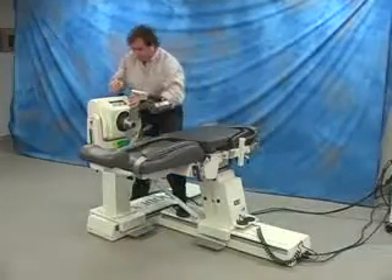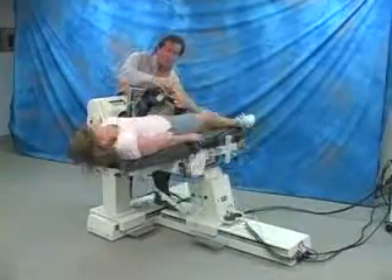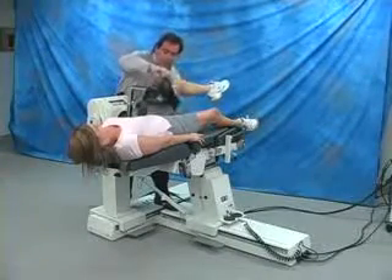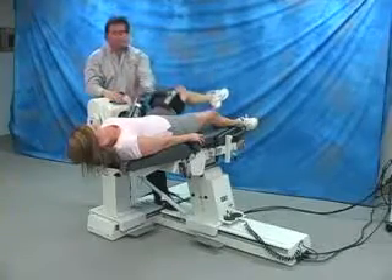Select opposite side hip attachment. Align axis of rotation and strap patient into the attachment. Set range of motion stops.